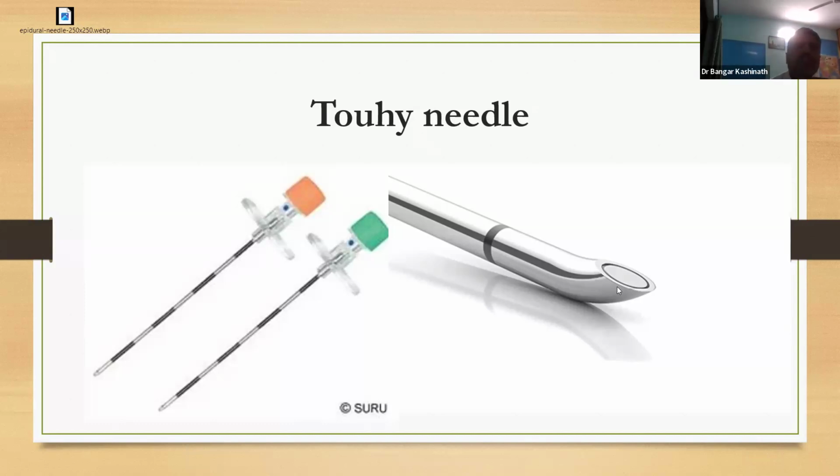One of the things is, if you want to pull out the catheter, then a Tuohy needle probably is not a very good option to pull out the catheter. There is a chance that the catheter can shear, right? In pain, for various indications like epidural or epidural adhesiolysis or caudal epidural, you can use the Tuohy needle.